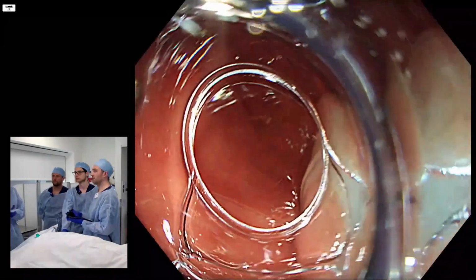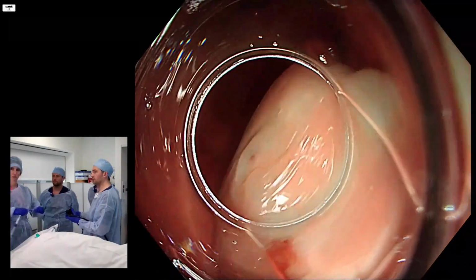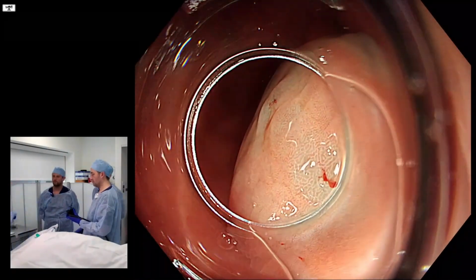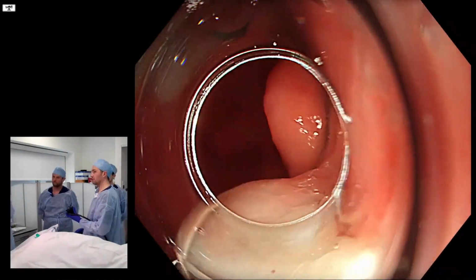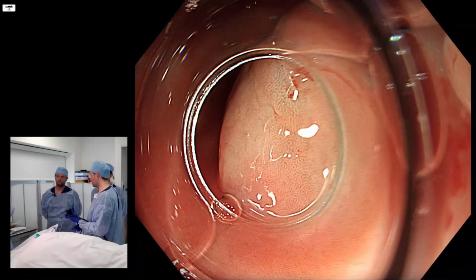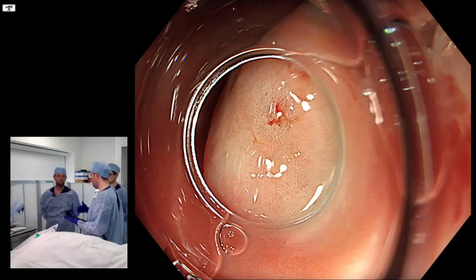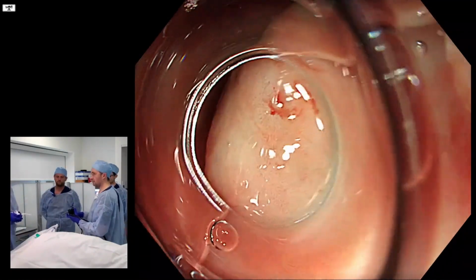Alright, now let's have the knife, please. So I'm going to open, okay, it's not the most ideal orientation, but alright, please, knife, please. Triangle knife. I'm going to open this near it, and then I guess go towards it with a tunnel and see how we go on. You got two options. One, you could make an incision from cranial corner, or you could go left, right. I don't think it matters. Not flushed yet.